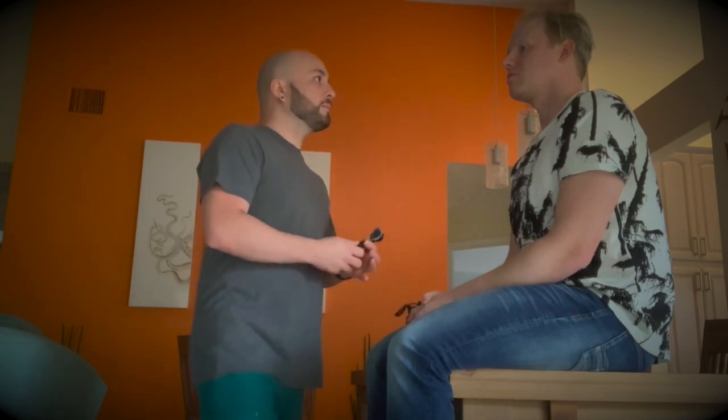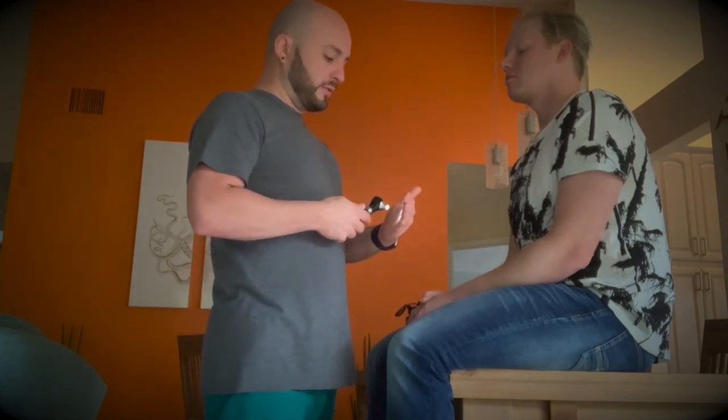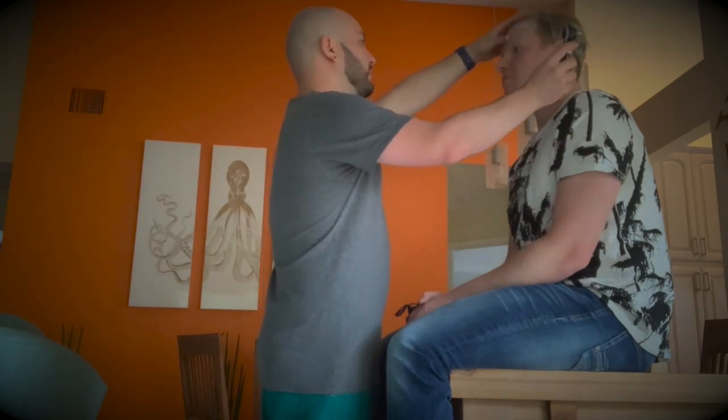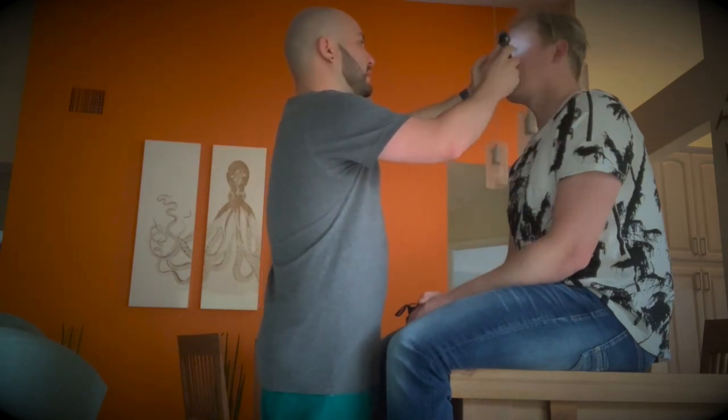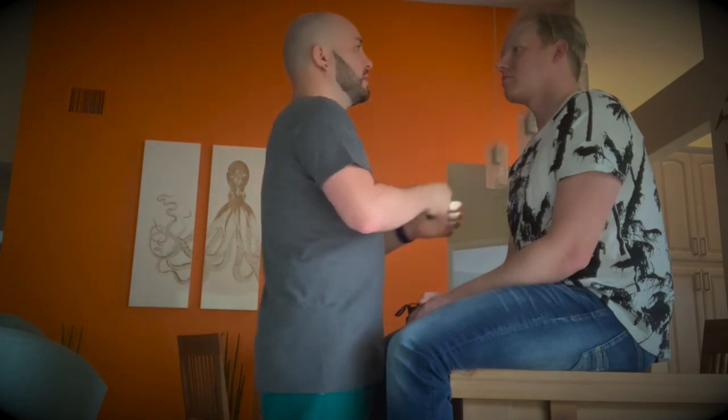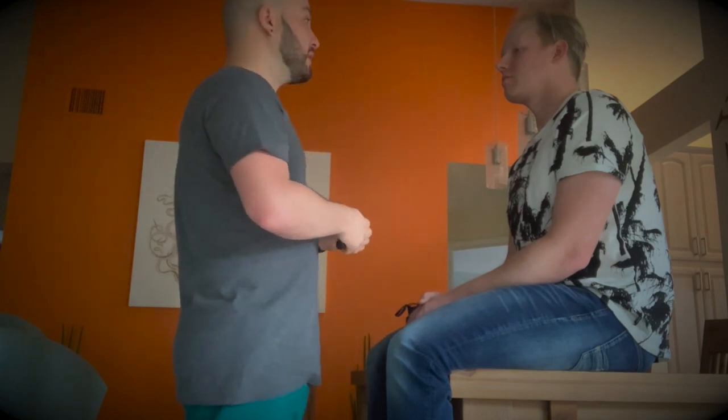Now we're going to check for pupil reflex. I'm going to turn my little flashlight on — look straight at me. Pupils are equal and reactive and equal accommodation.